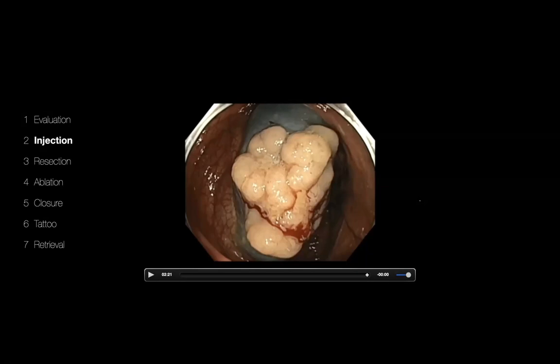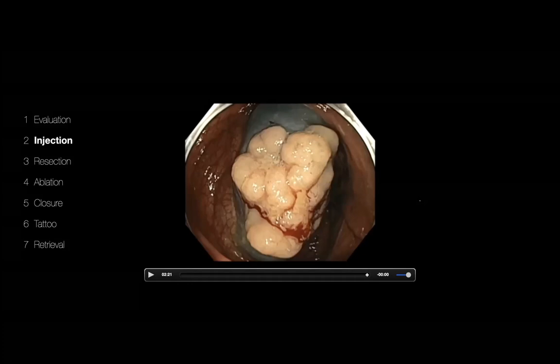Especially this was a screening colonoscopy in a 50-year-old. You don't expect a large polyp in a 50-year-old. The percentage of patients with large polyps in a 50-year-old is probably very small. So when you wanted to resect this lesion, you would be struggling if you didn't have a cap. So it's a good idea to start your scope with a cap as a matter of routine, if possible.